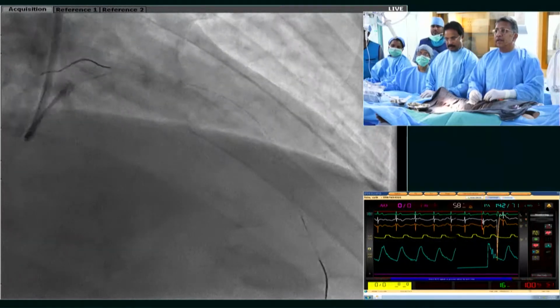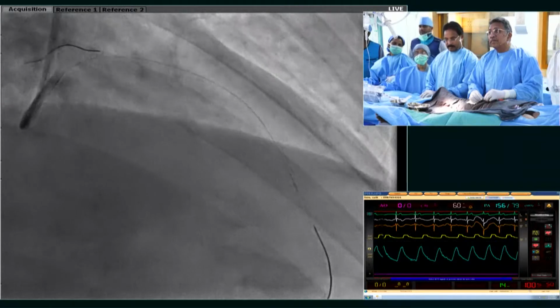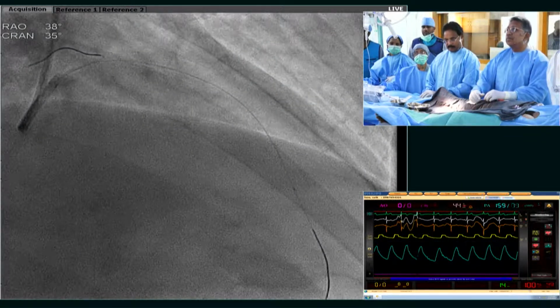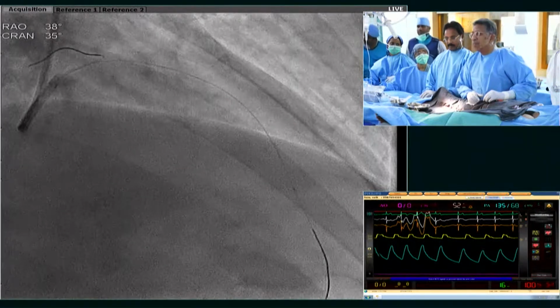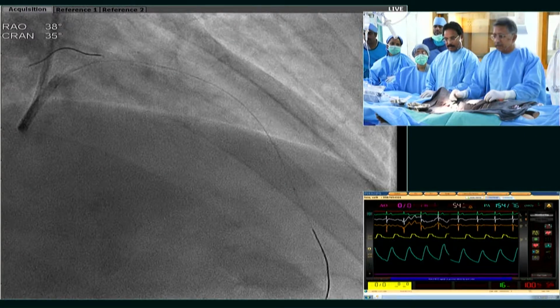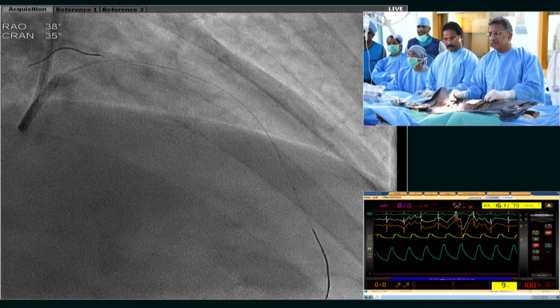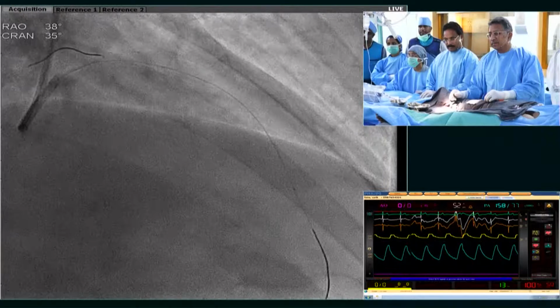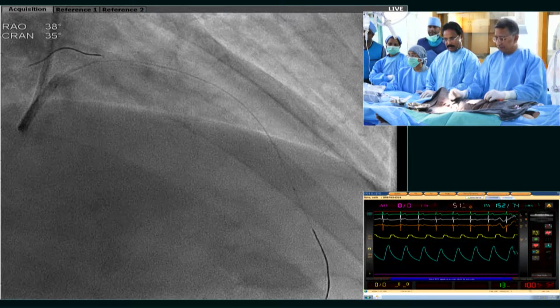Good. To stent from the distal left main to the proximal or maybe mid LAD, with pre-PCI imaging in order to correctly size the length and the diameter of the stent. And probably a one stent strategy would be, I think, the first option to propose. It's a big vessel. If you look at the distal LAD, it looks like at least 3.5. So it's a big vessel. So you can use a 3.5 and you can go up to even 4.5 in the left main.